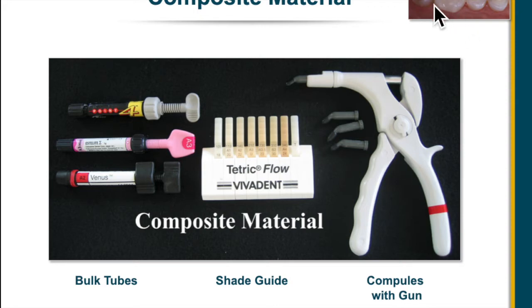And again, I put this picture up here to remind you what we're talking about. We're talking about composite fillings, not amalgam fillings. And you can see they did a nice job selecting a shade for these teeth. And then this is a composite gun and composite compules.